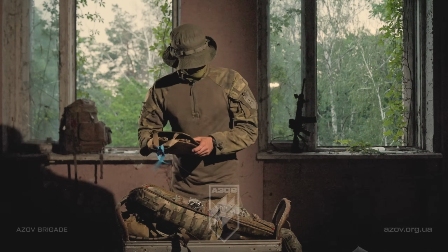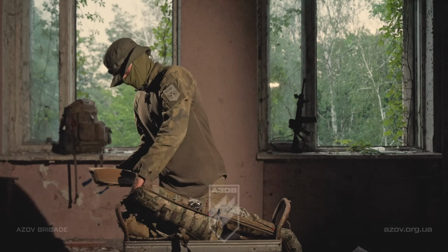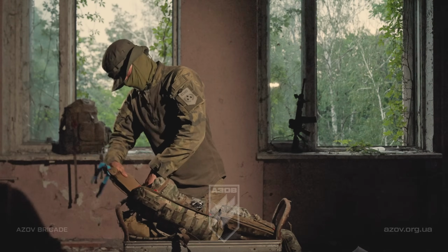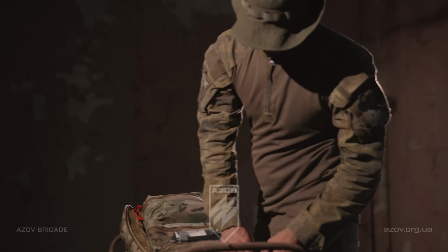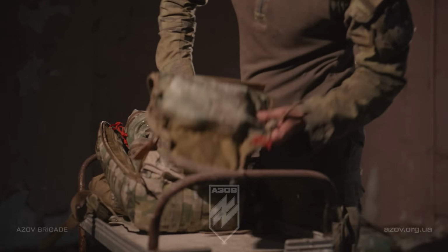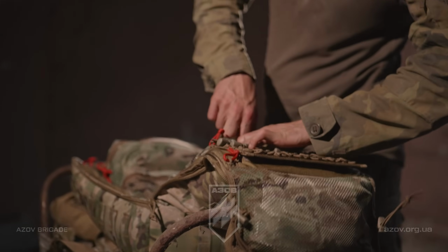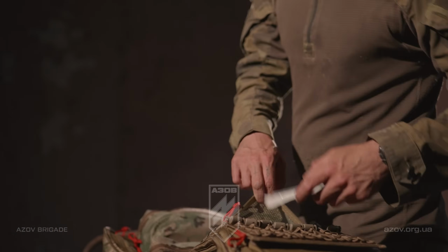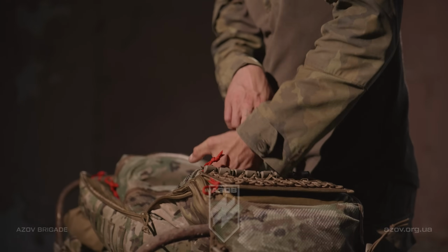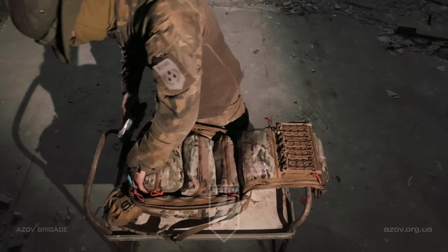I like this, but I prefer my little pouch I got from Ewan. Very, very good brand. It's strong, sturdy, it's going to protect your medicine. So going into this pouch here, you've got syringes, 5, 10s and 20s. You've got catheters as well for your IV lines, and you've also got a couple of lines there tucked away in the back. This is how you push your medicine through a casualty.